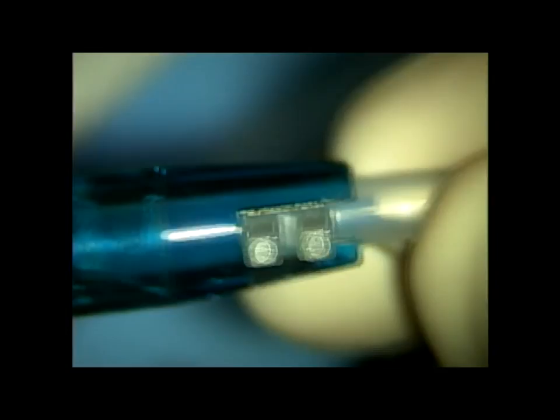We backfill the cartridge made by Star with OccuCoat. The instructional videos from Star say to also use a little BSS, so we dilute the OccuCoat just a little bit. Then we take the foam tip plunger and insert it into the Star injector system to make sure the foam tip applicator engages with the internal cartridge within the shooter. Then we just soak that in BSS.